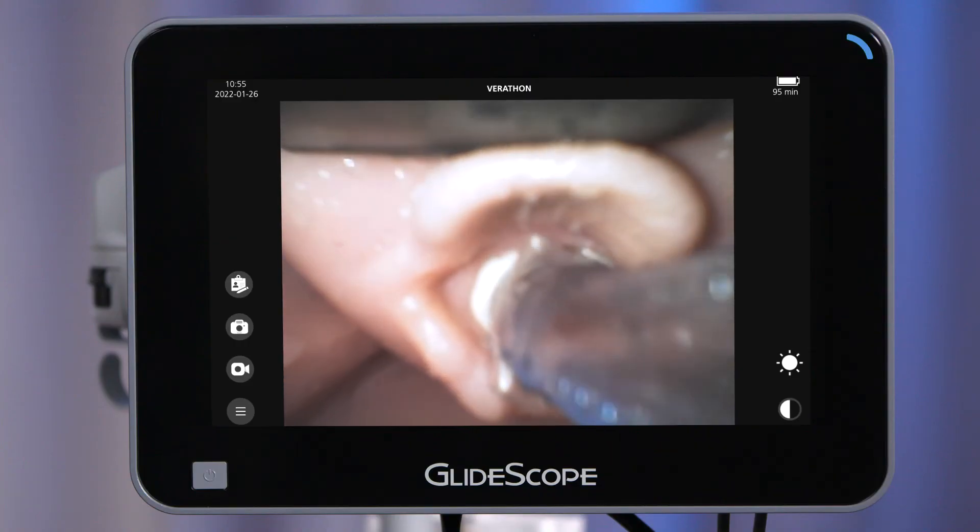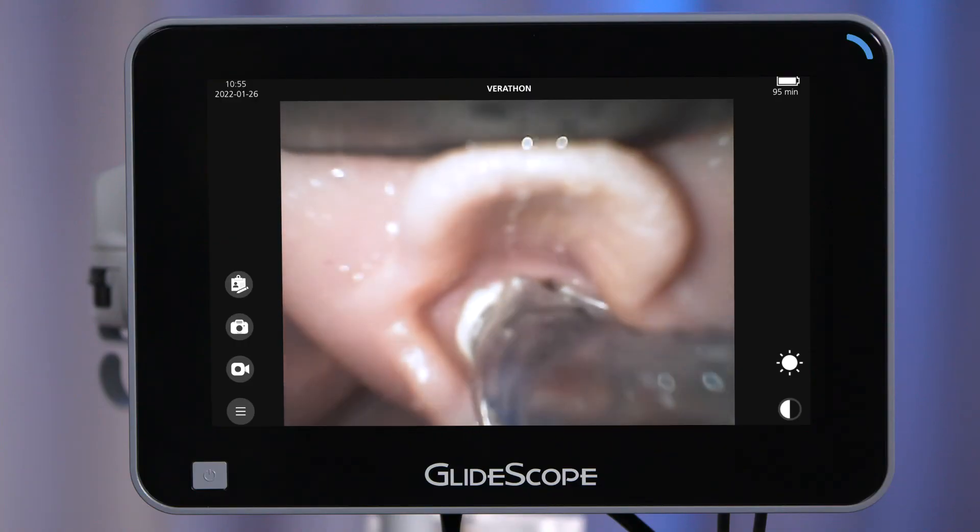Do not insert the stylet through the vocal cords. If using a preformed rigid stylet, remove it in the direction of the feet of the patient. Lubrication of the stylet may help facilitate removal from the endotracheal tube. I've also found hyperangulated blades to be useful when performing nasal intubations. The intubation can be performed easily and without the use of McGill forceps.